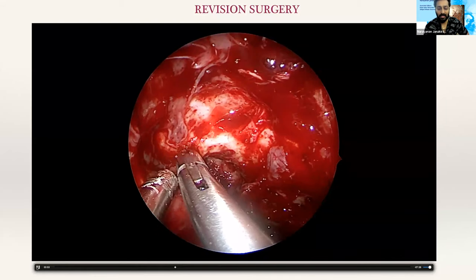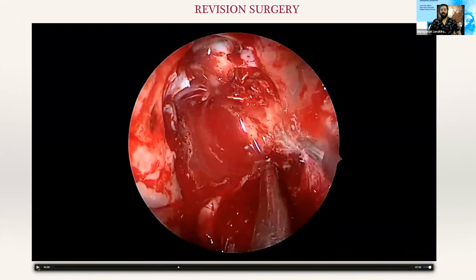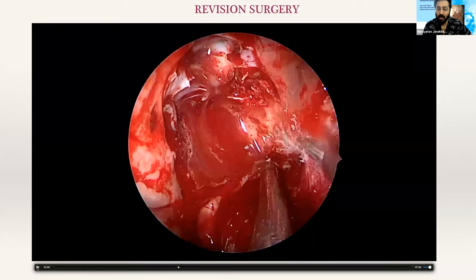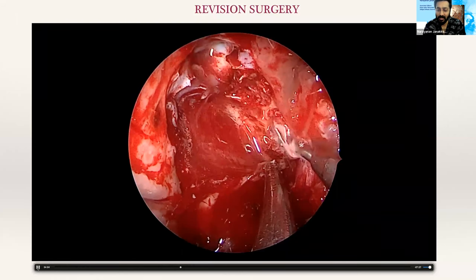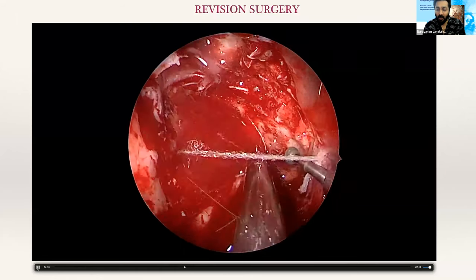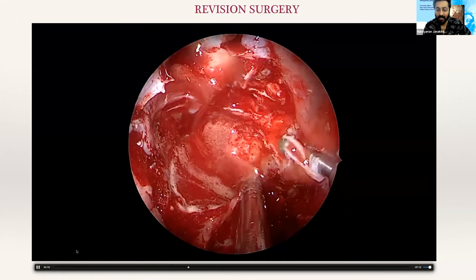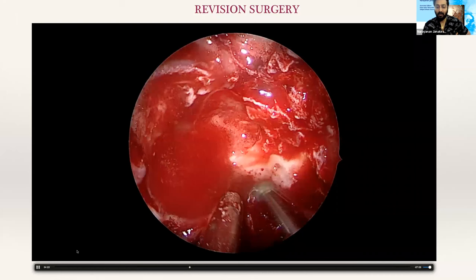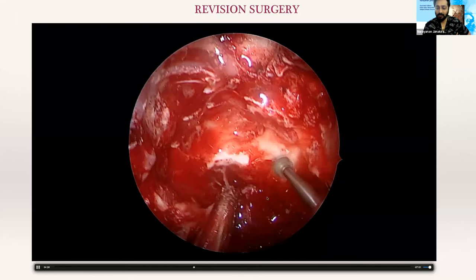I'm getting the anatomy of the carotid artery — you can see a mass just in the inferior part of the sphenoid sinus. Now I'm drilling over the maxillary strut. Again and again: if you have to remove tumor from any crevice, you have to release it from the bone. The maxillary strut is just anteroinferior to the superior orbital fissure. The tumor involves the superior orbital fissure, so I'm now releasing the bone to expose the carotid artery, because we have feeders from both ICA and ECA.